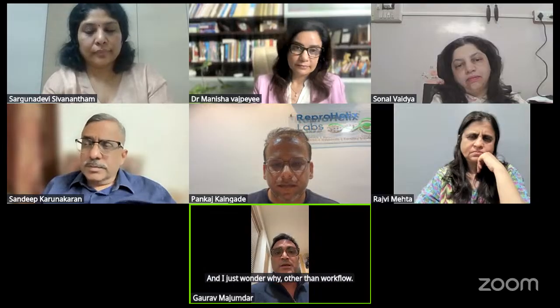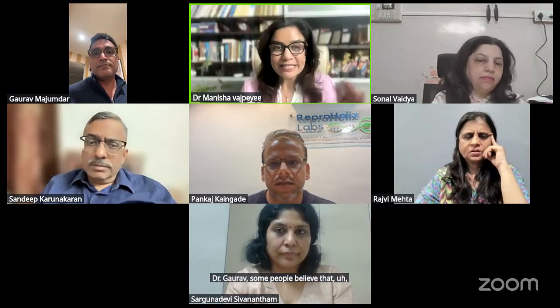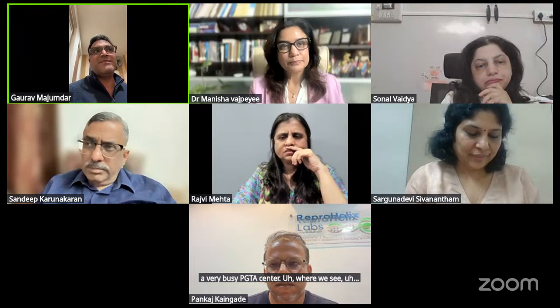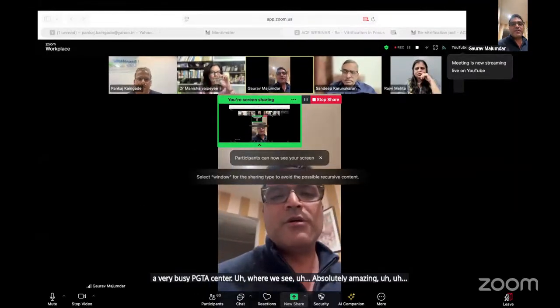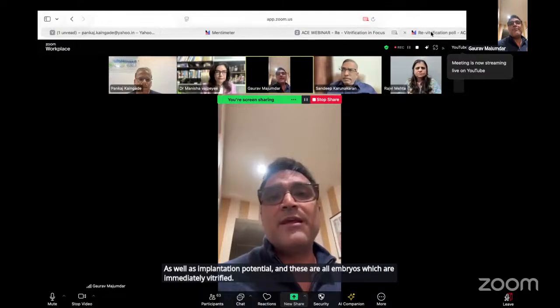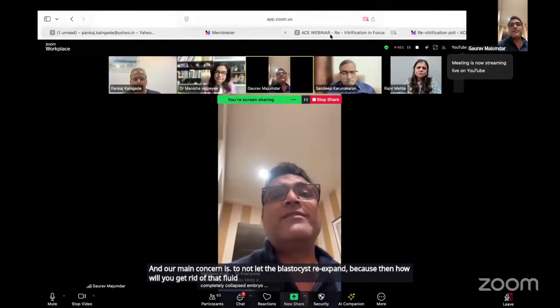And I just wonder why, other than workflow issues, why would you let the blastocyst re-expand? Dr. Gaurav, because some people believe that the blastocyst has already been traumatized, so give it enough time, because I have attended such lectures as well. That's why I specifically asked this question. You can take it from me, in a very busy PGTA center we see absolutely amazing survival rates as well as implantation potential. And these are all embryos which are immediately vitrified. Our main concern is to not let the blastocyst re-expand, because then how will you get rid of that fluid inside? Very logical.